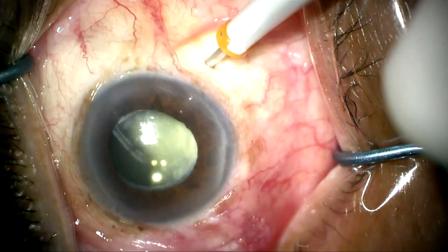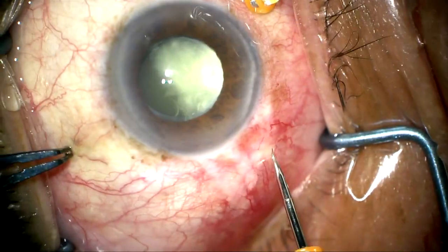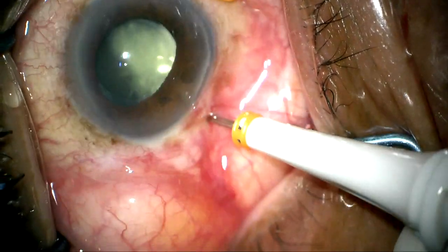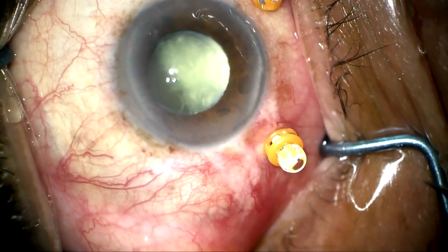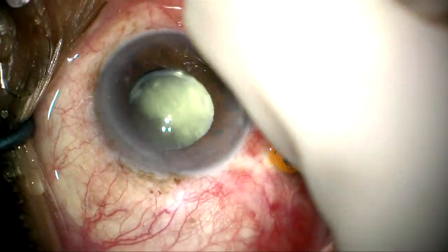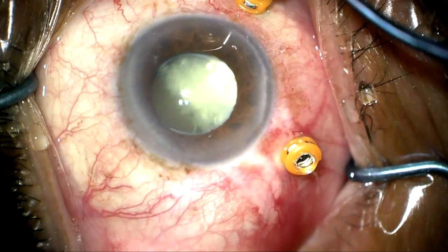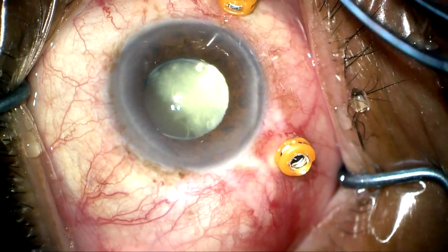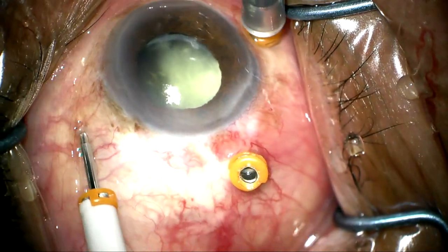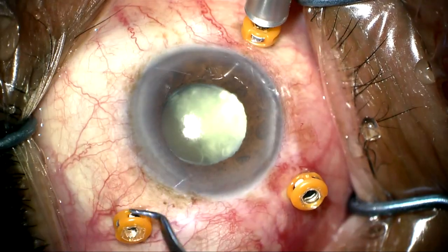Here I'm rotating the eye up a bit as the block has forced the eye to rotate in a downward position a little bit. So I'm placing my trocars inferiorly so the infusion line can push the eye up into a position where it's better centered. And I'm putting my infusion line in here because the eye is a little soft after placement of the second trocar. This will firm up the eye before I put my third trocar in for easier penetration.